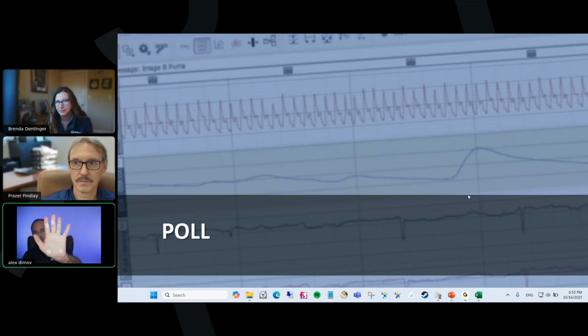Let me just show something real quick. You can see here the spots from where the gel was on my hands when I just removed the electrodes, right? So that's how we know you put enough gel. Everything's looking nice and wet still.